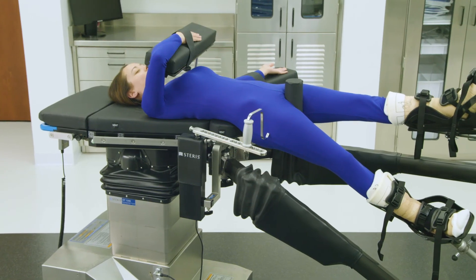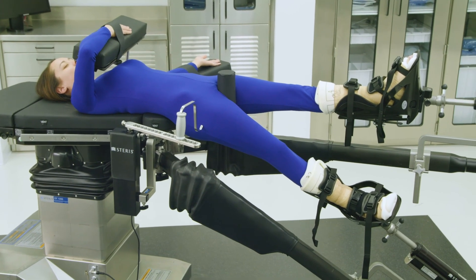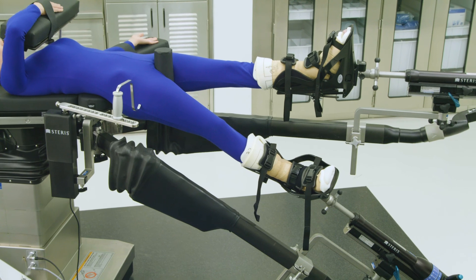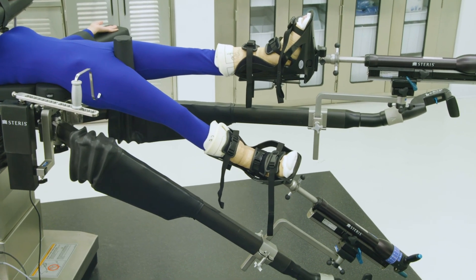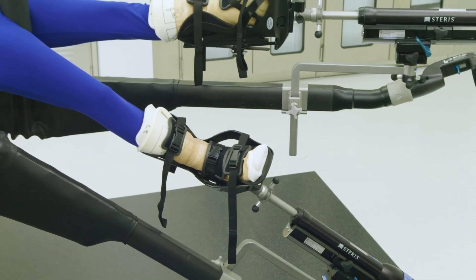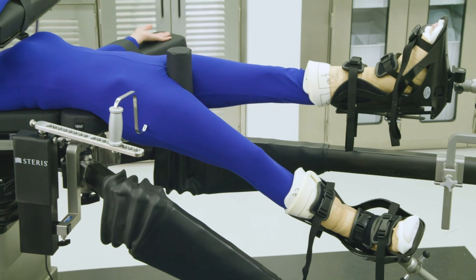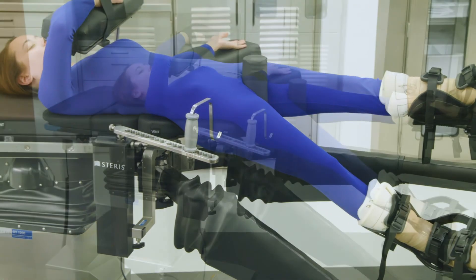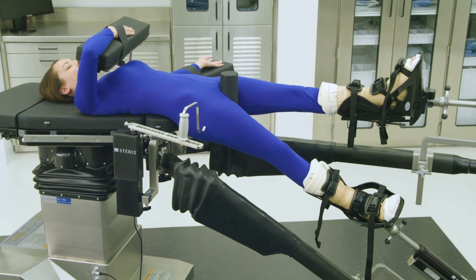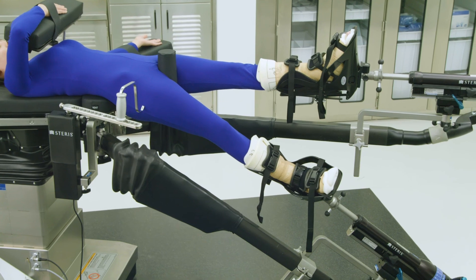During an anterior approach total hip arthroplasty case, special positioning will be required for the operative leg. To achieve appropriate exposure, the surgeon will instruct the surgical nurse to rotate the operative leg externally to dislocate the operative hip after the femur's head has been cut. Typically, external rotation will be between 70 and 110 degrees. During the broaching phase, the surgeon will instruct the nurse to lower the operative leg to the floor and adduct it below the non-operative leg to provide exposure to the femoral shaft for broaching. Refer to this common anterior hip table positioning for reference only; appropriate patient and clinical positioning may differ.